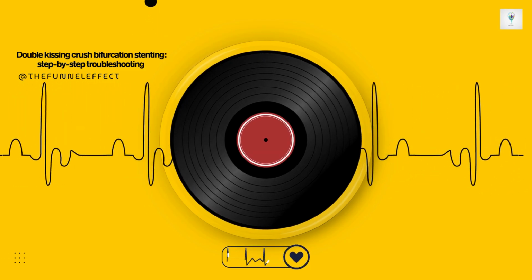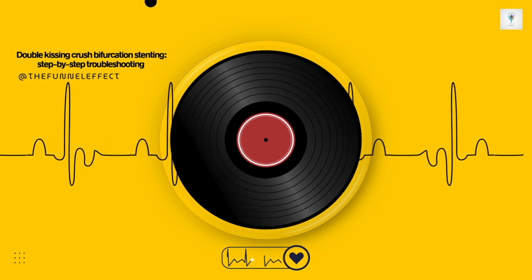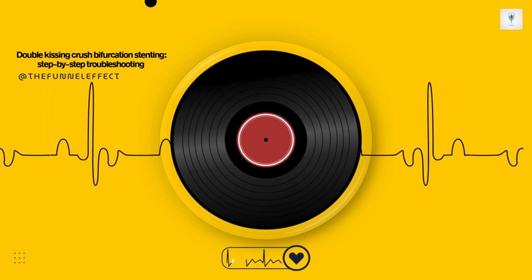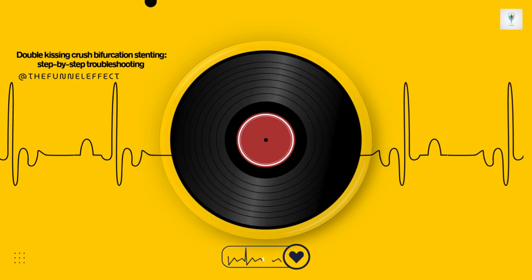It's totally critical. For this first POT, the distal marker of the POT balloon needs to be positioned precisely at the carina, right at the flow divider where the vessel splits. Too distal, and you risk distorting or crushing the SB ostium area. Too proximal, and you don't achieve that crucial flaring of the struts covering the SB opening. Right at the carina is the target.